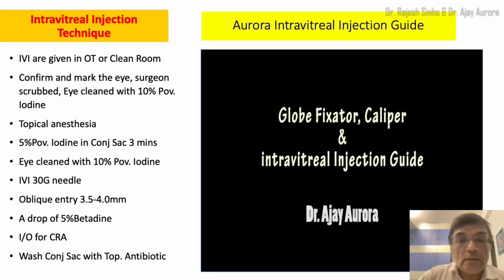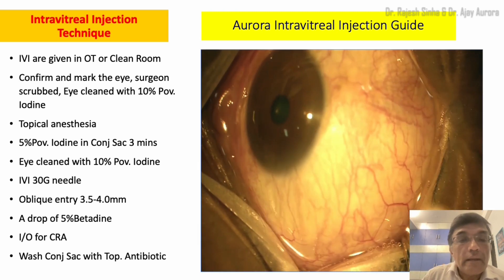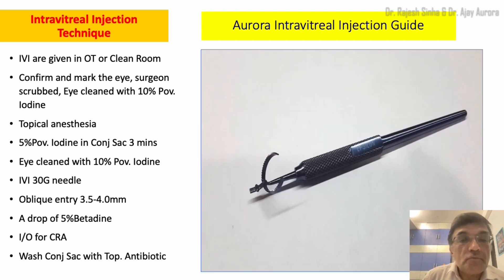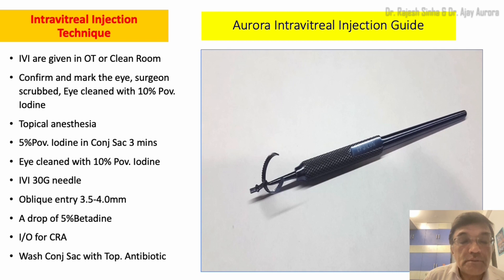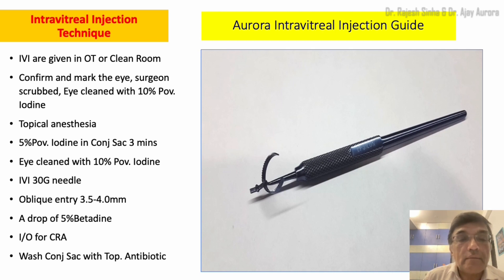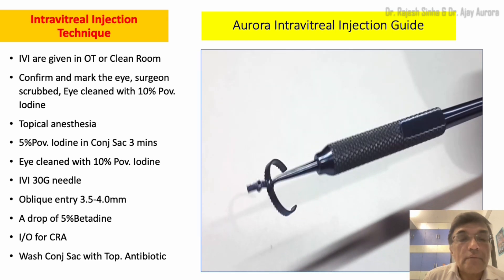This is an easy way of giving intravitreal injections. If you see in this particular video, you will find that the patient was not able to fixate and was moving the eyeball very rapidly. So the only way to give an intravitreal injection would have been to fixate the globe with forceps, measure the distance at which the injection has to be given — meaning both hands would get occupied — and then give the intravitreal injection. See how I did it differently.